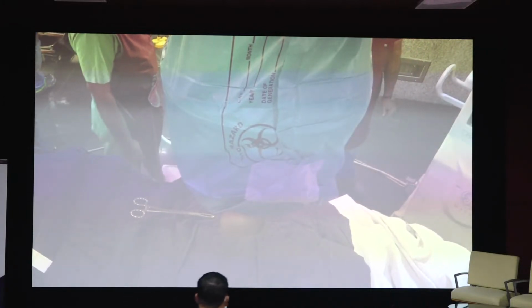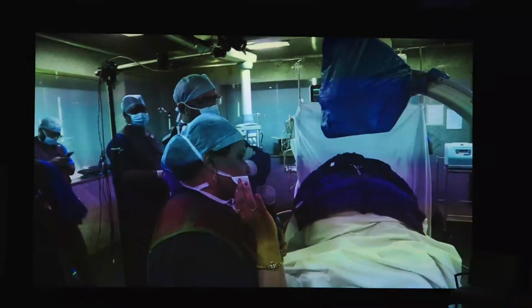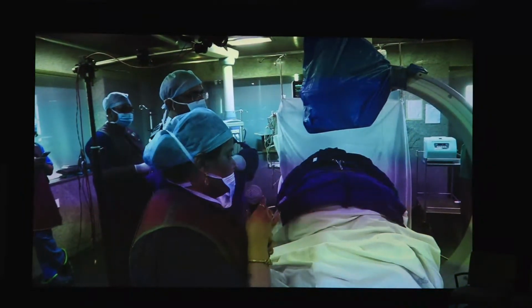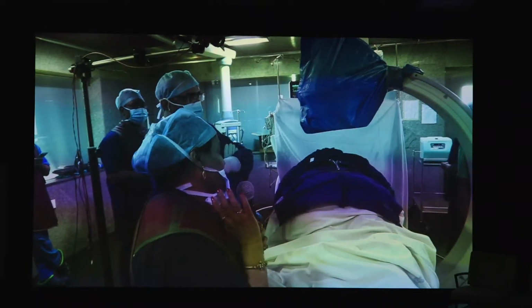Our second case is a 21 years old male with history of sports injury 4 years back. Clinically it is an SI joint pain. Provocative tests are positive. SLR and all are negative. Spine examination and the MRI of spine is normal. He was comfortable with conservative treatment for the last 3.5 years. Now from the past 6 months it is aggravating. So here we are giving a diagnostic SI joint injection right side.